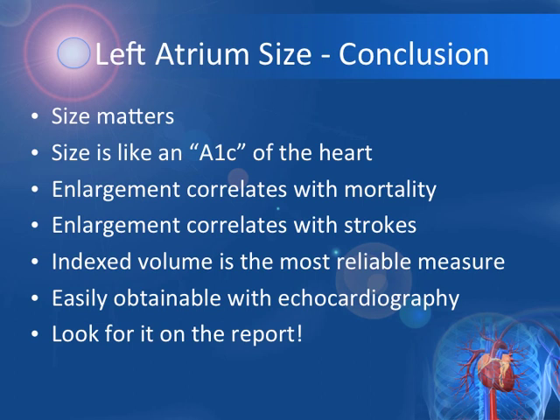We need to look not only at the LV systolic function, the diastolic function, the aortic and mitral valve functions, and the right ventricular systolic function, but the left atrial size, especially presented as an indexed volume, will give you a very strong predictive value for your patients.